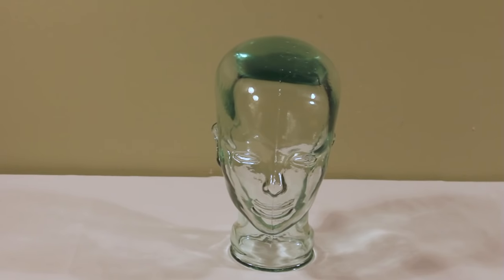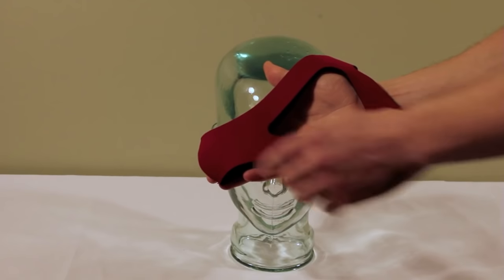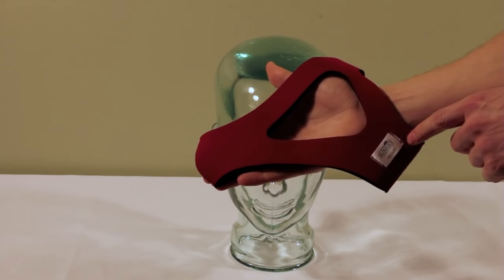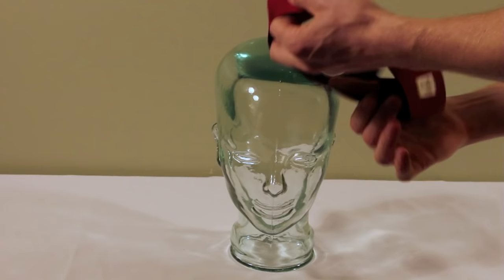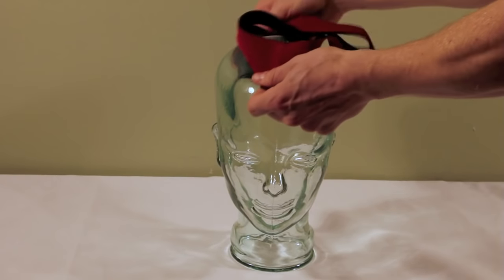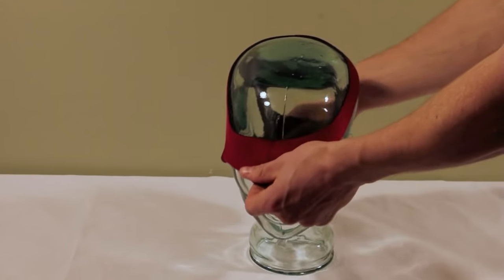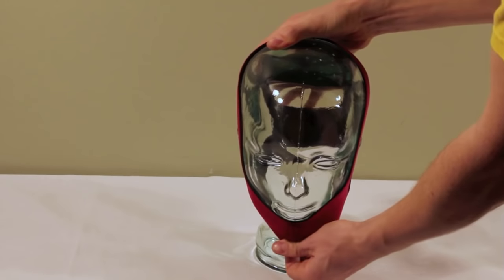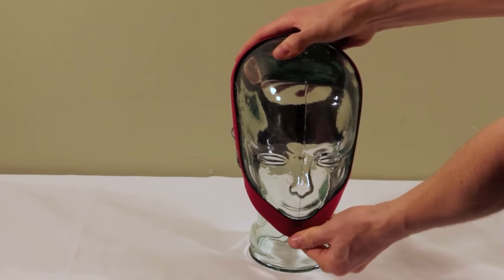Now I am going to demonstrate how to fit the new ruby chin strap. You want to keep this curved edge in the front of the patient and make sure that the tag remains in the back. Then you are simply going to slide it over the patient's head until the curved edge securely cups the patient's chin.